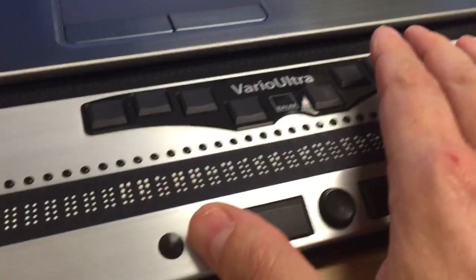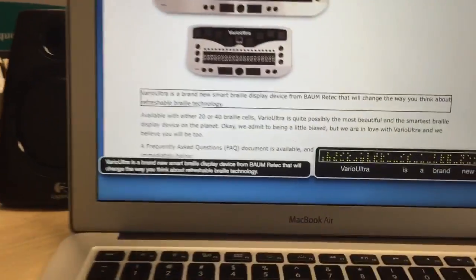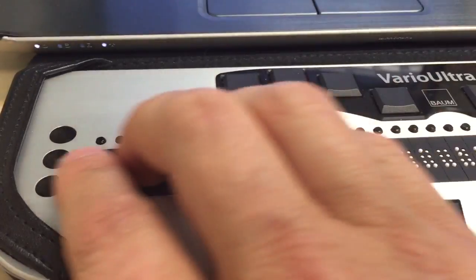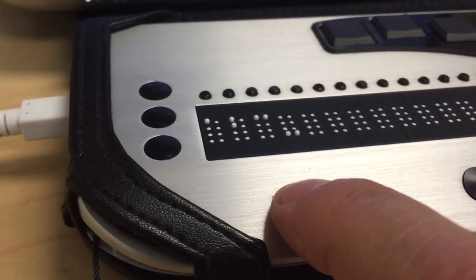I'm going to press the S2 key — I believe it's with B8 for channel four — and it's confirming that it's connecting to the MacBook. Over here, we're using the MacBook Air with VoiceOver, inside the Safari web browser, looking at our website with HTML content. We can be working simultaneously; I have not disconnected from the PC. I can switch back to braille note taker mode and the word processing file with the letters ABC that I typed earlier is still there, right where I left off.